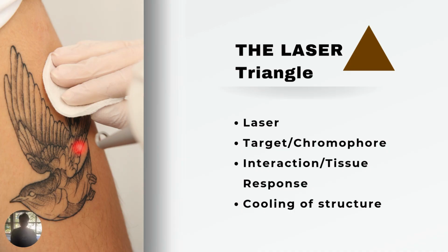Assess, adjust, assess, adjust. And lastly, to lessen thermal injury and to protect the top layer of the skin, we need to have cooling at all times. When technology, especially lasers, generates heat, we have to control the heat by cooling it down.